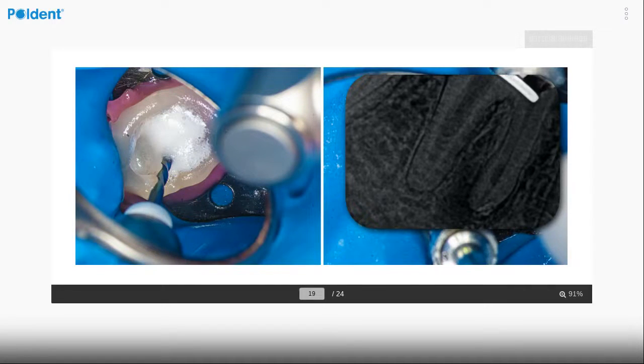And then there's a very important stage. Of course, we are not able to perform micro CT during the treatment, because we would have to extract the tooth and send it to the university. But we can make an X-ray in one projection, maybe with a distal shift sometimes. And this is very important for me because sometimes in the isthmus there can be hidden sealer or a small piece of gutta percha.